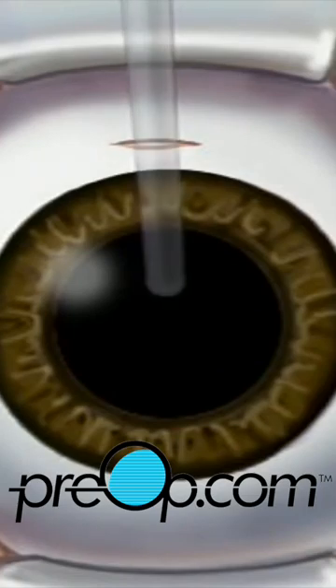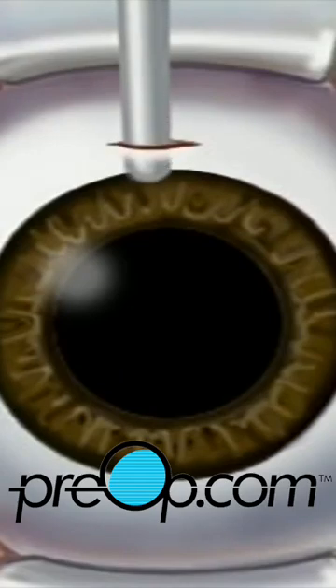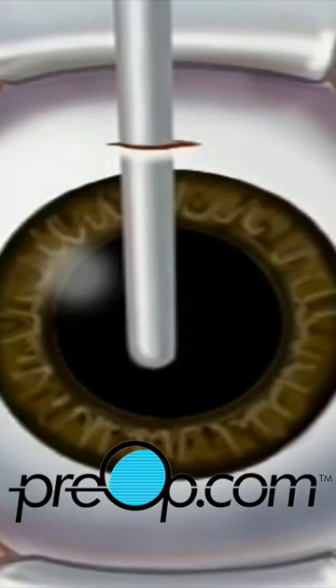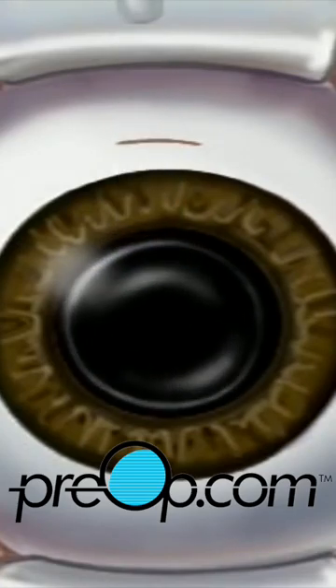Through the small incision, the surgeon will then insert the new lens. The lens is actually rolled up inside a special injector, designed to fit through the small incision made above the iris. With the tip of the injector inside the eye, the surgeon slowly injects the new lens where it unfolds into position.